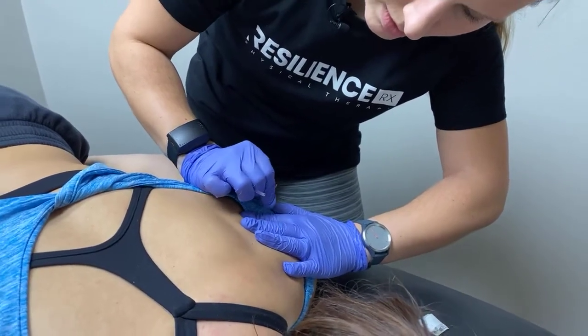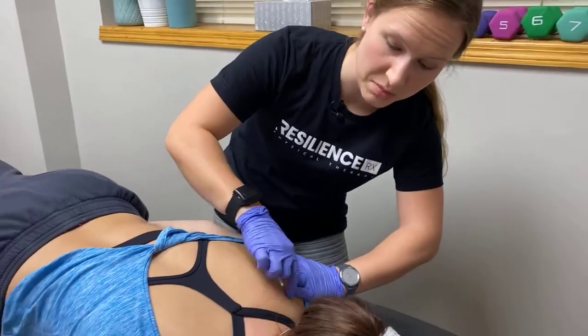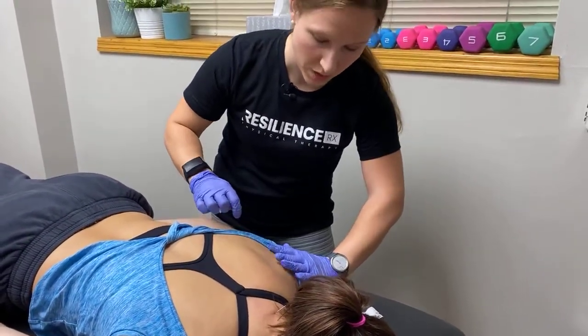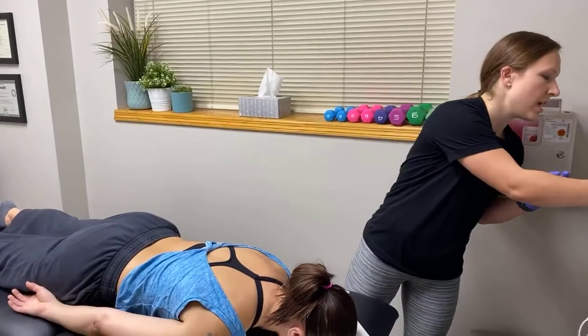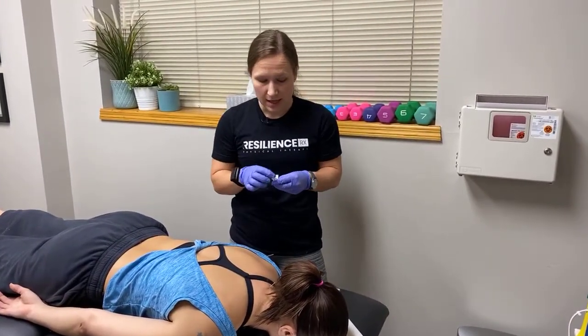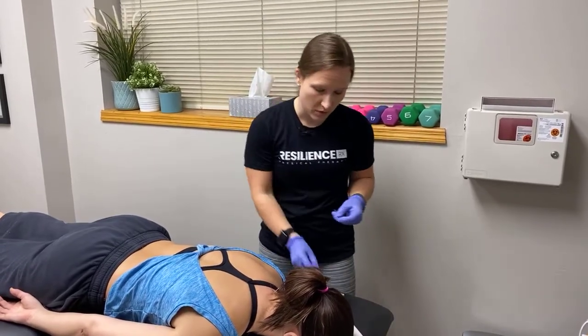So with this, there's been a couple. You might have been able to see it, but these muscles up here contracted, and then through here it contracted a little bit too. That's pretty typical. We call that a twitch response. It's basically the muscle contracting and then fully relaxing. And that's what we're looking for with dry needling. That helps a muscle that's partially shortened, fully shortened so that it can relax.